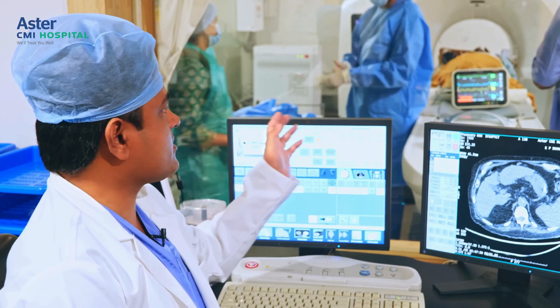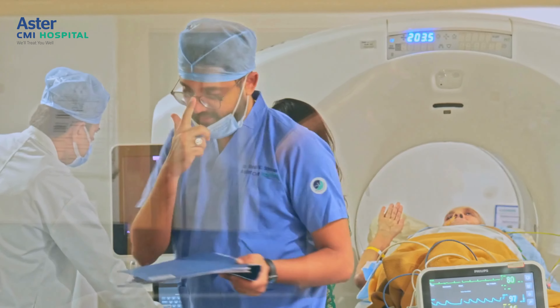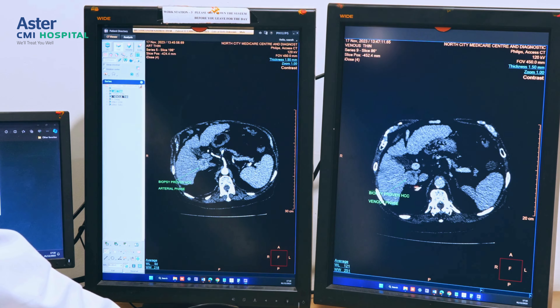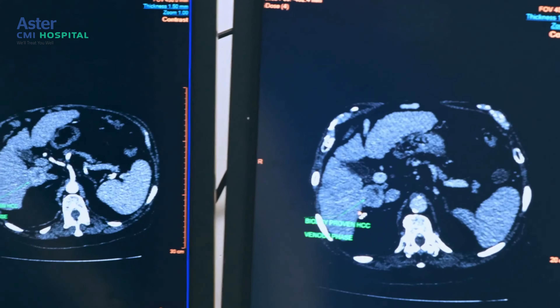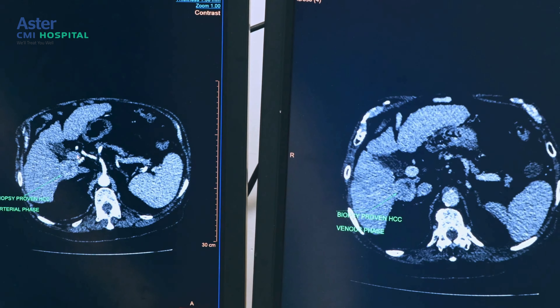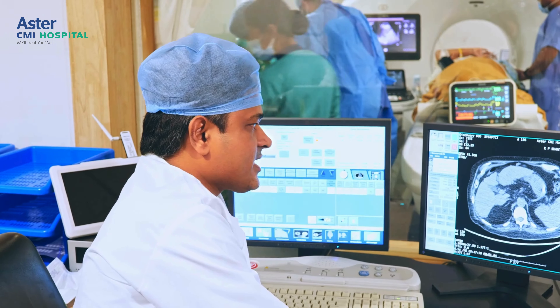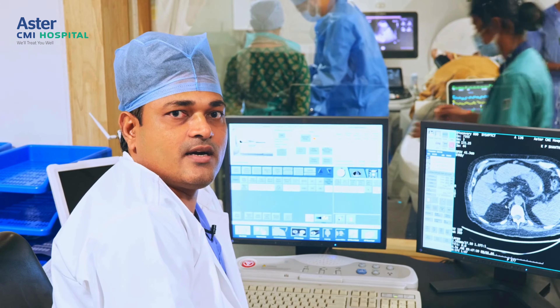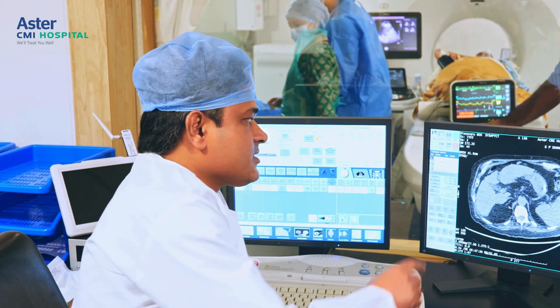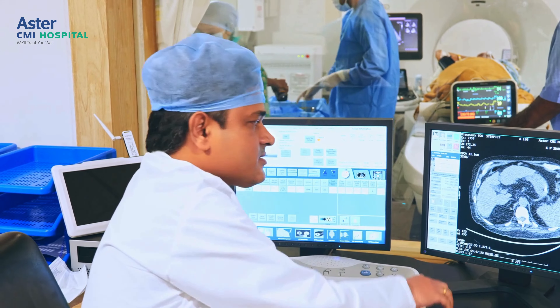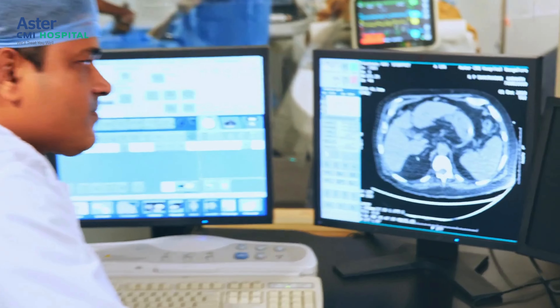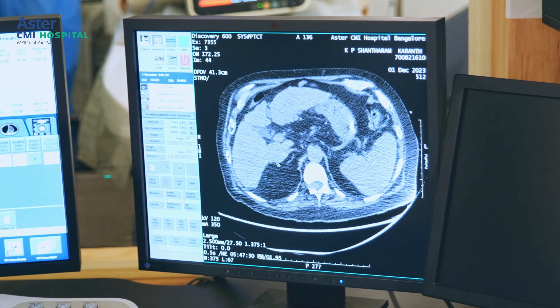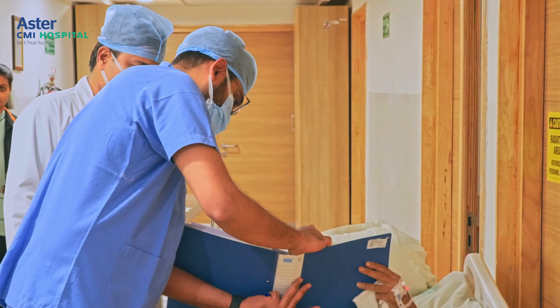We have taken the patient on table in the CT room along with the ultrasound machine. We are going to combine the ultrasound and CT images to do the microwave ablation of a difficult location liver tumour, that is in the caudate lobe. We have taken a plain CT here. Earlier we showed the same patient's CT scan — arterial phase and venous phase. This is the pre-ablation CT scan where we are seeing biopsy-proven HCC in the caudate lobe. Now we are moving to the procedure.